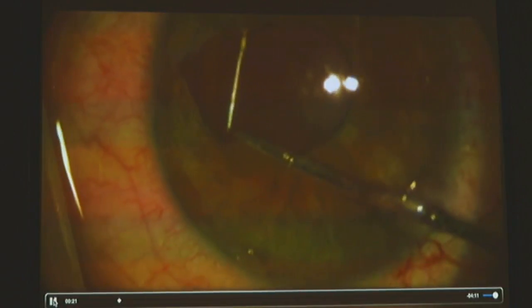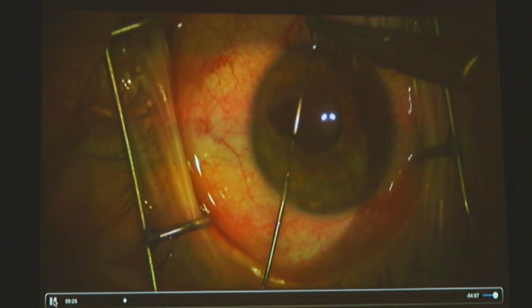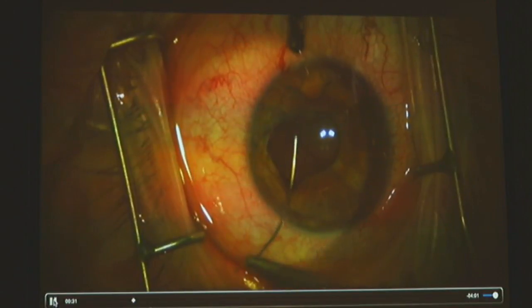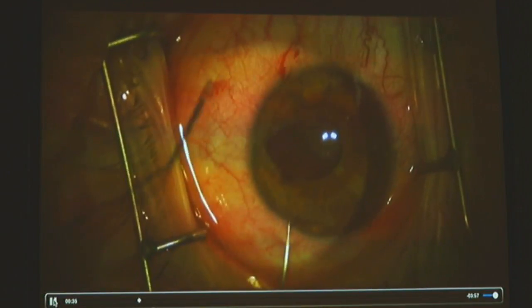We go from right and left hand to pass the needle with one hand, other hand, grab the instrument with either hand. So as eye surgeons, we have to use both hands, not just one hand. We're bimanual surgeons. We want to be careful and use the right approach. Now we pass our suture all the way through.